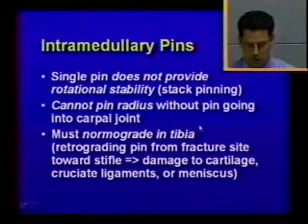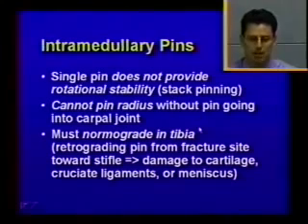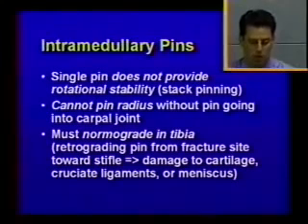Intramedullary pins are commonly used in fracture repair. It's very important to remember that a single IM pin will not provide rotational stability. So to help this, we'll do what's called stack pinning, and this is where multiple IM pins are used, and that way we do get rotational stability as well as the bending stability that is provided by the pins. Important to know that you cannot pin the radius without the pin going through into the carpal joint and injuring the articular cartilage, so we don't recommend pinning of the radius.